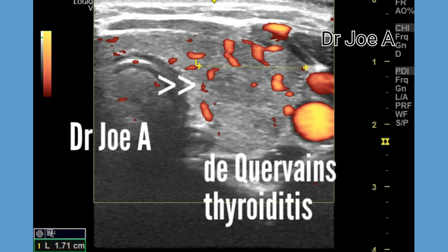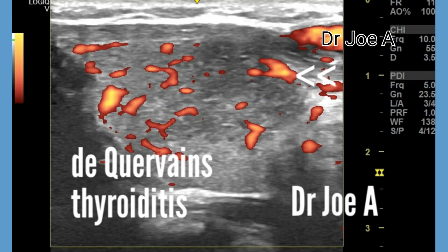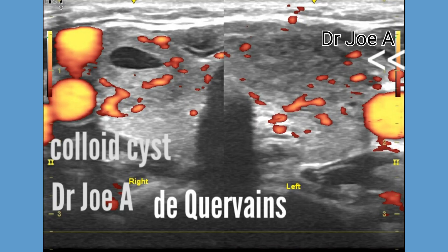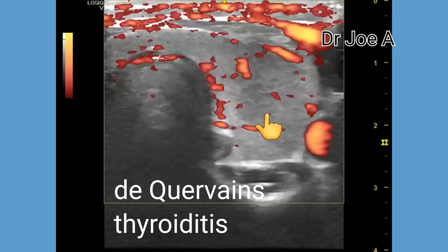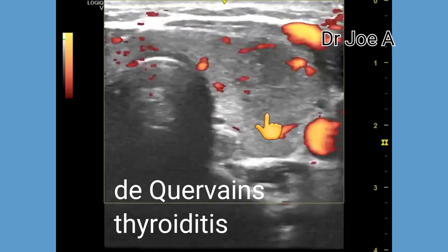De Quervain's thyroiditis is an inflammatory condition affecting the thyroid gland in this patient. It is characterized by pain and tenderness in the left lobe, along with fever and an elevated ESR.